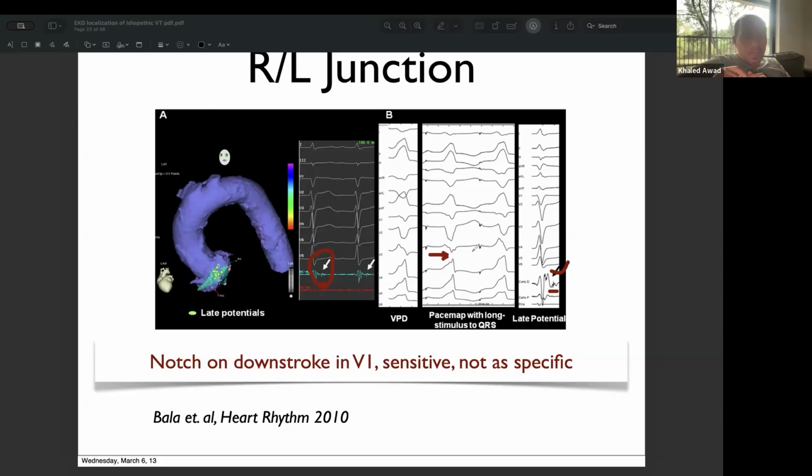It is likely causing the arrhythmia you're dealing with, but you're just capturing it and exiting in a different direction than what the site of origin does when you're not there and pacing. You ablate it and literally it makes things go away. So you're ablating without a good pace map, without adequate activation, but based on understanding of the EKG and understanding of the pathophysiology of the area that you're working in.